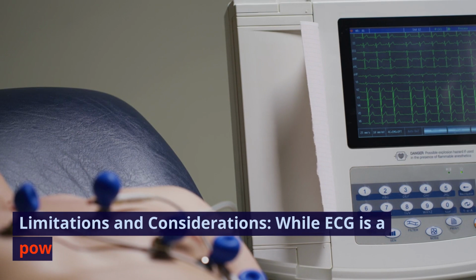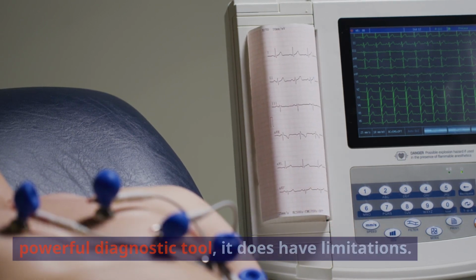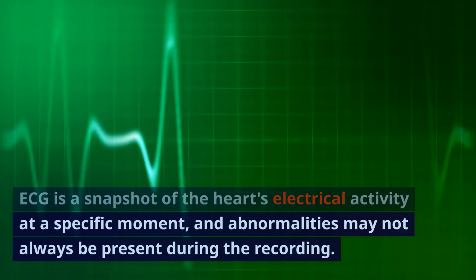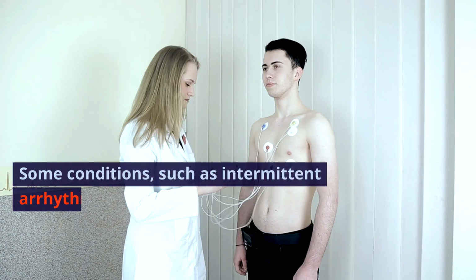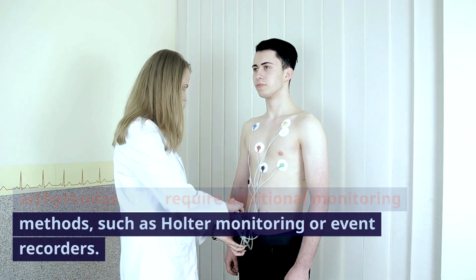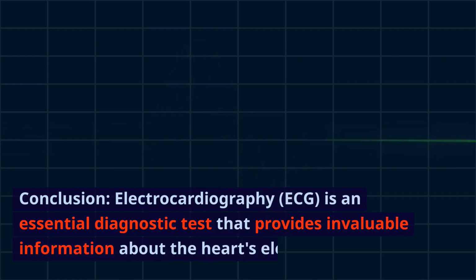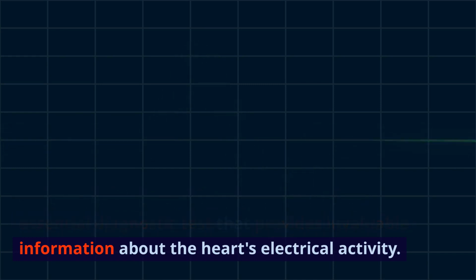Limitations and considerations. While ECG is a powerful diagnostic tool, it does have limitations. ECG is a snapshot of the heart's electrical activity at a specific moment, and abnormalities may not always be present during the recording. Some conditions, such as intermittent arrhythmias, may require additional monitoring methods, such as Holter monitoring or event recorders.